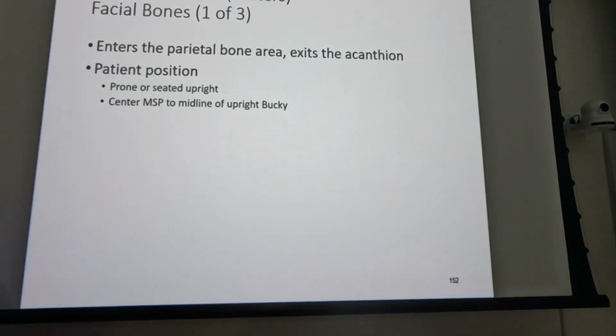So our projections are the difference between the two. The original Waters is what we refer to as the 37 Waters, and the modified Waters is the 55. Let me get to them in the book. Okay, all right, so on page 61, that's the original Waters.